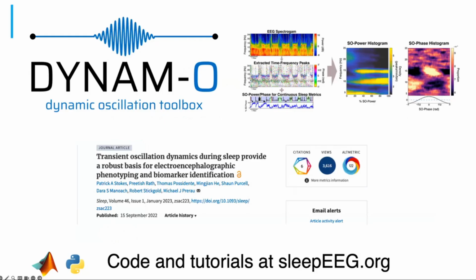My name is Mike Prerau. I'm a researcher here at Brigham and Women's Hospital and Harvard Medical School. And today I'm going to talk about some of the work that my lab's been doing over the past couple of years. In particular, an open source software package called DYNAM-O, the Dynamic Oscillation Toolbox.